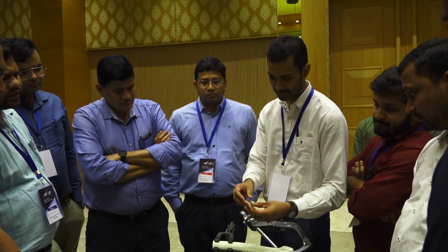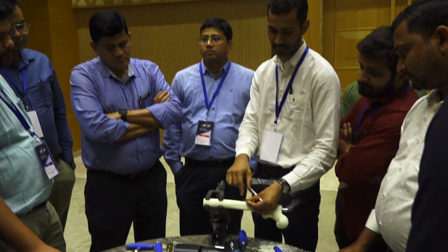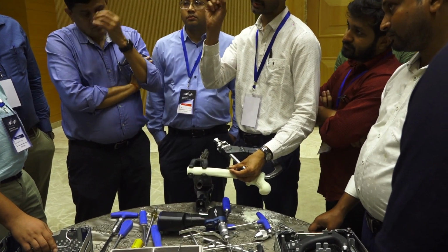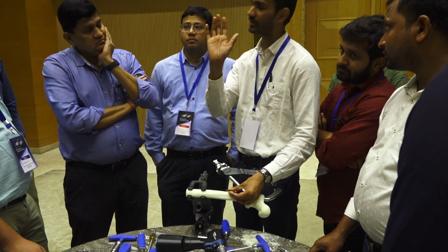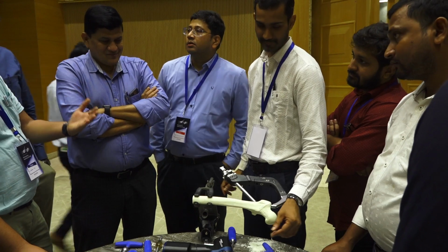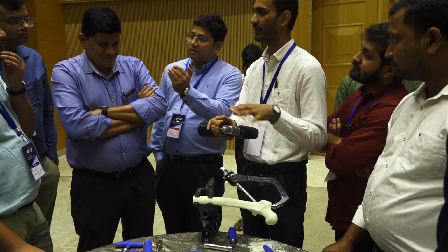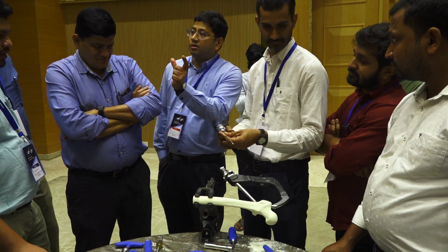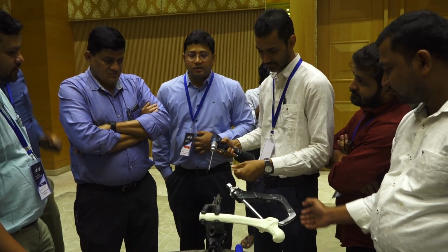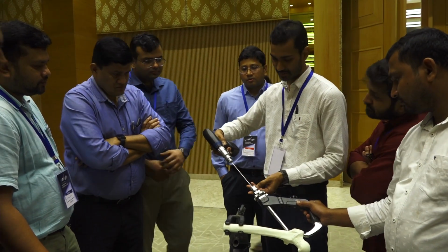This design will remain flush like this. It is not like PFN A2 or PFN A where there are big screws. There are several advantages. That will also buttress the screw, the compressive flush. If you give a very long one, then it will stand out. So this is a 3.2 guide pin, 3.2.